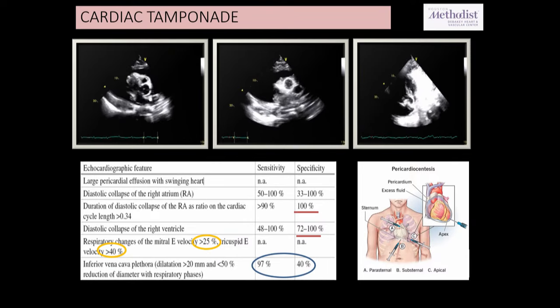Circumferential, right? Most of the time when you do an echocardiogram, you look at the pocket which is the largest in dimension, and go for that, right? So the paraapical region is mostly safe. And the biggest risk we carry with any pericardiocentesis is basically hitting the ventricles or anything within the cardiac structures. So that's one thing which is very important.